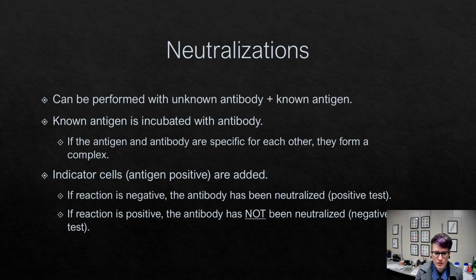Okay, neutralizations. This is performed when you have an unknown antibody and a known antigen. And usually the antibody is not completely unknown. You're suspicious that it is one antibody, but you're going to confirm with the neutralization. And then you can also use the neutralized plasma to complete your antibody ID.